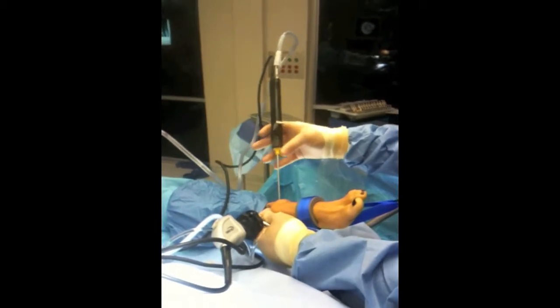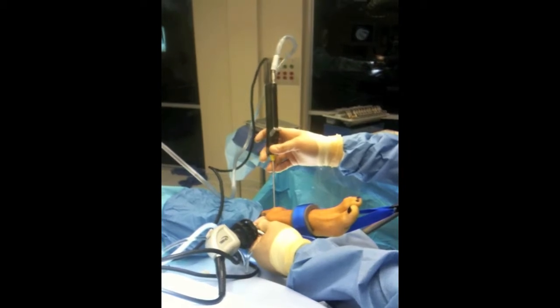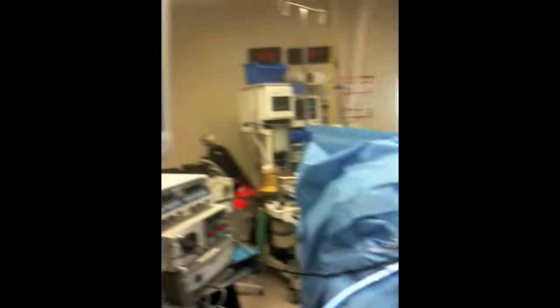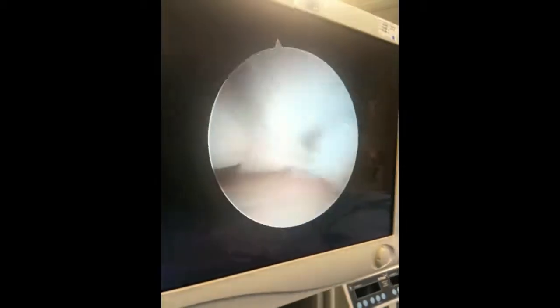Here's the actual resector that I placed in the ankle joint, replacing the pointer I had earlier. Up on the screen, you can see that I'm going to turn it on, turn the suction on, and start to clean out some of this stuff.